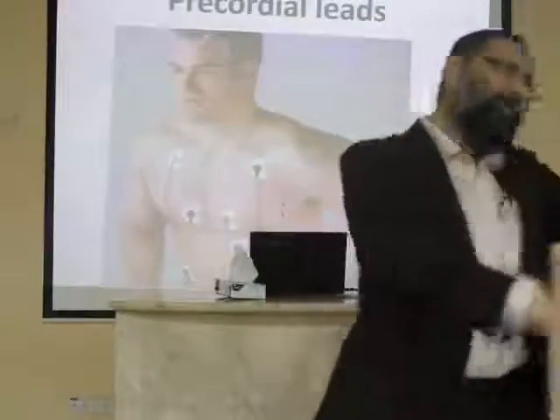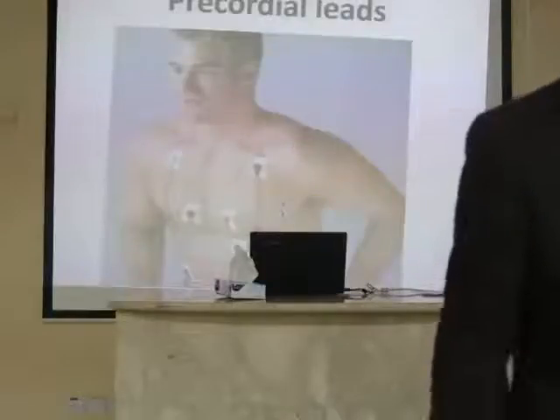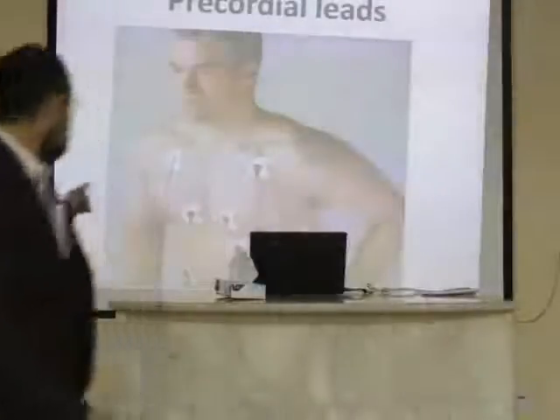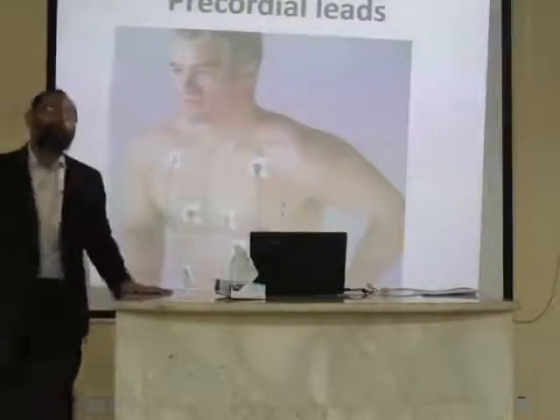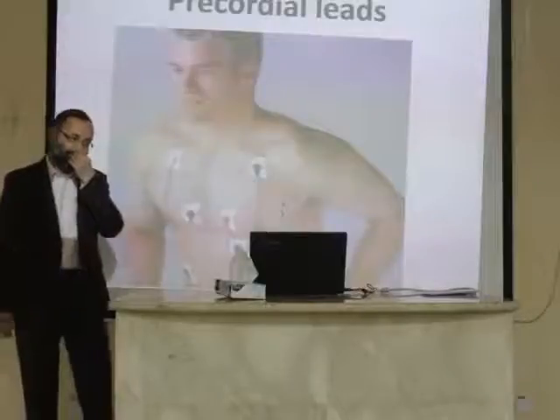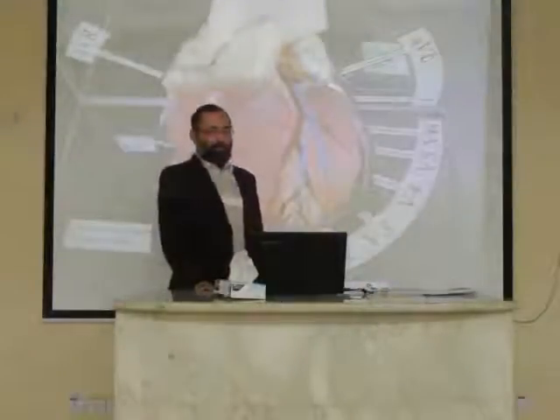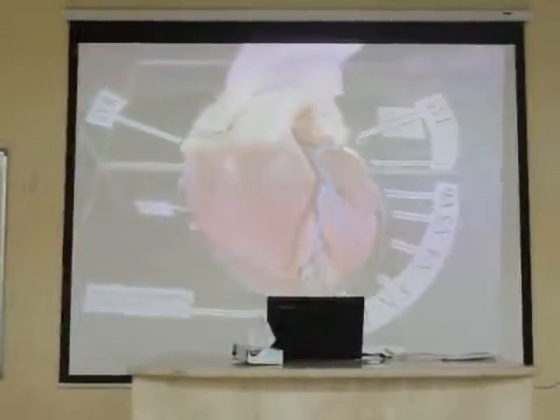Okay. This attachment will come in the lab, inshallah. You will attach yourself and see. Okay. The idea is that this is a unipolar system, and that will give you a recording. Now, a very interesting point is coming. Look at this picture. Alright, this is the heart. Okay?